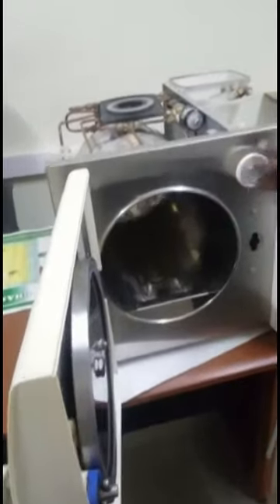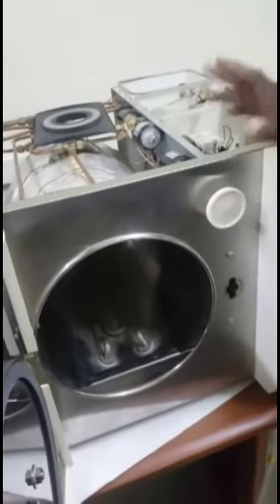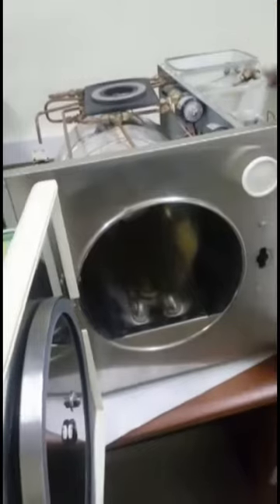Then we also check the filters. This is the bacteria filter in front. We check this to see whether it's okay. It's supposed to be changed once every year, same with the gasket. But because it's not available, we'll be managing with it.